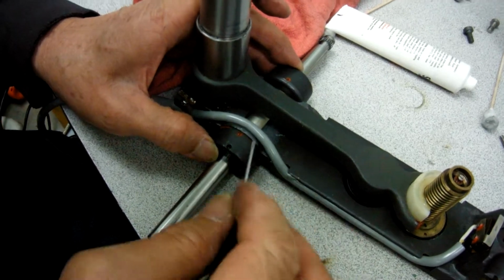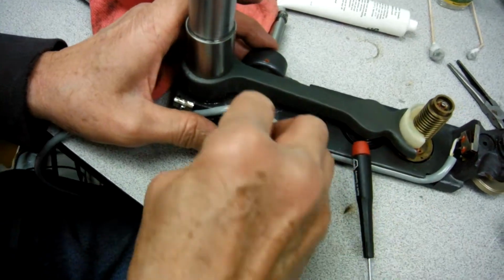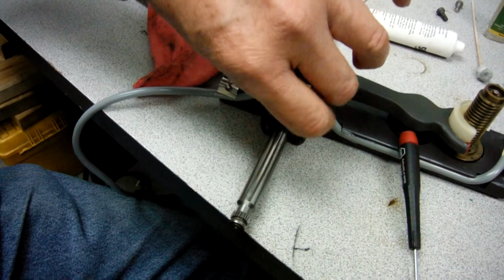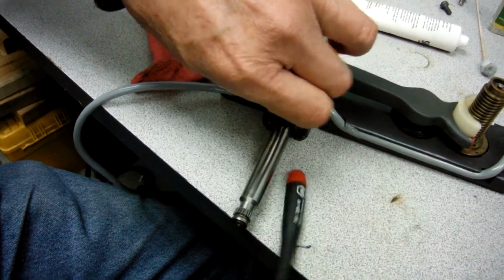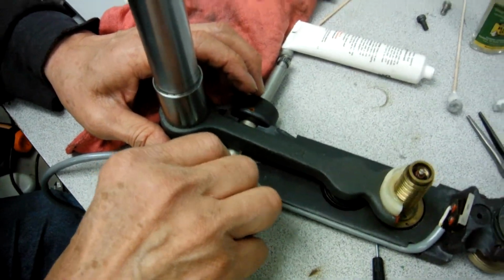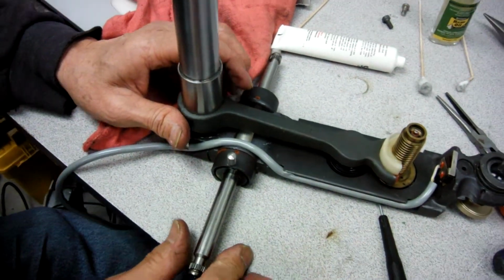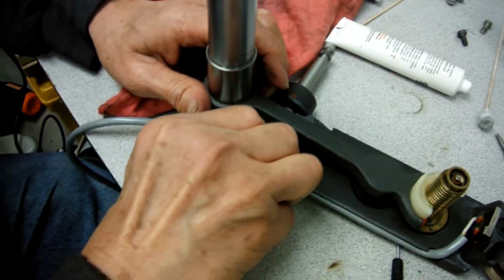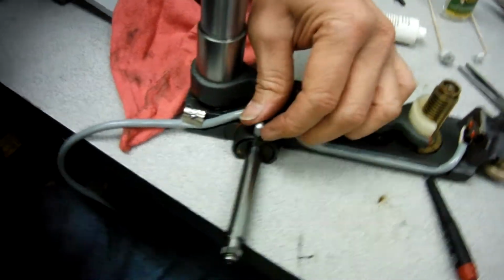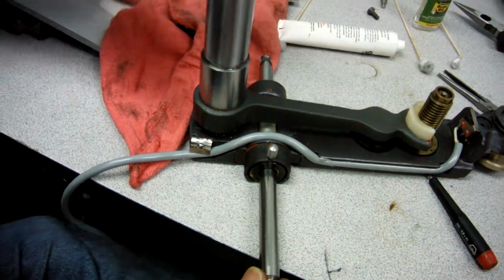It's a little bit tricky to put this one in there, so you have to make sure you put the piece there, go down there, and then the knob goes into it. Again, this knob is kind of opposite. If you go counterclockwise, that means you lock, and if you go clockwise, that means you release. So right now I'm going counterclockwise all the way, and that means it locks the shaft in place. If I go clockwise like this, that removes the shaft. Lock, okay?